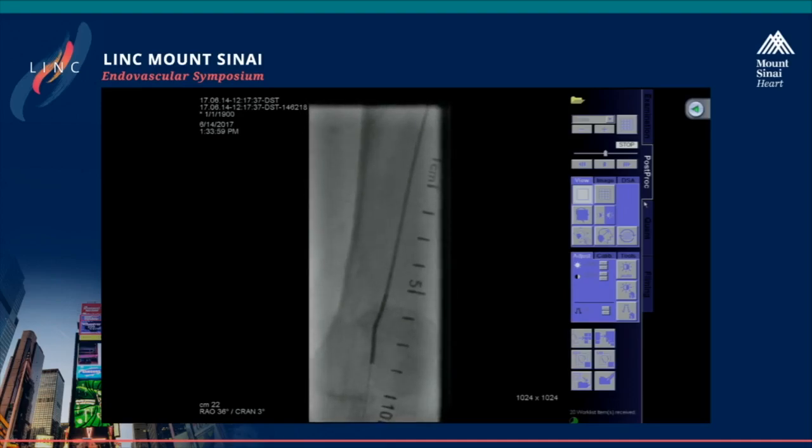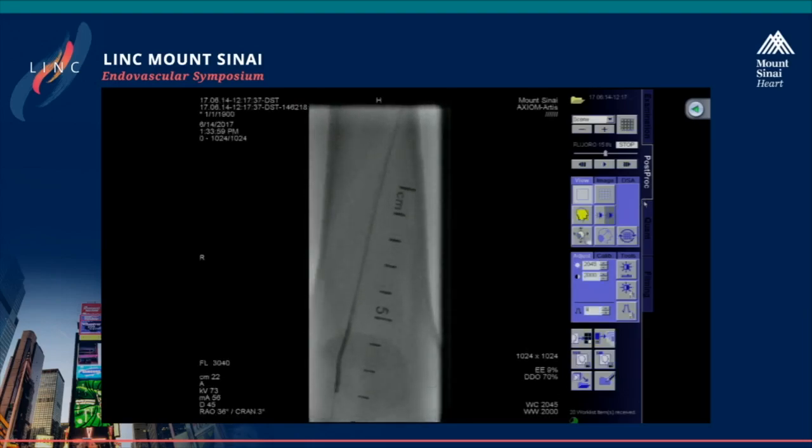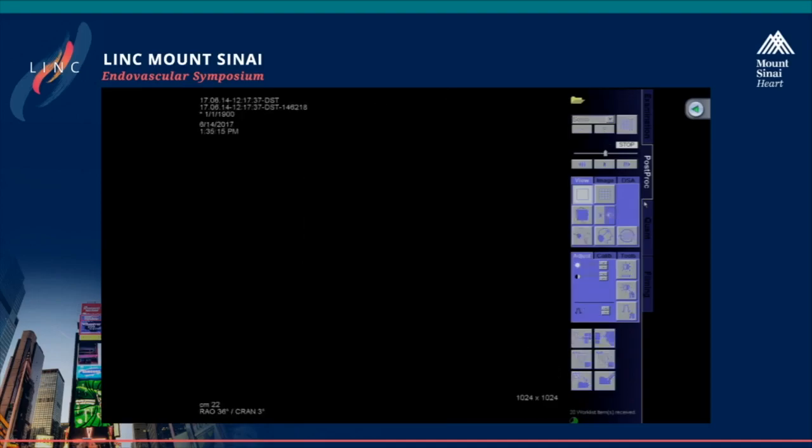Okay, we're just going to push the wire up. We're going to see whether we can take this all the way down. No, it's not going. So walk this out. You want to try with a Fine Cross here? Push the wire a little more, Vishal. Wait, actually, we can always do the Safari, not come from above. Let me push the catheter from above. Rail the wire, guys.